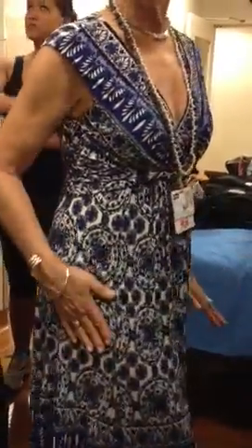But remember, if you don't put your palm on this one, you're definitely going to be too far up. And if you have short fingers, your tendency is going to be to come up and touch the crest, but then you're going to be off of the palm, and then you're going to be against the bone. If you give it up here, this is just pure bone. So if you're not keeping your hand on this trochanter, then that's where you'll get it.